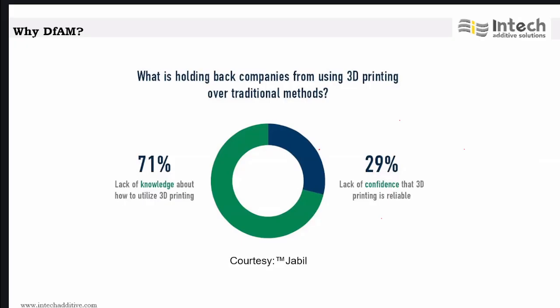It's like designing specifically for the process. They think in a traditional way, thinking about CNC compatibility, or if it is injection molding, about being molding friendly and so on. But 3D printing requires different thinking. It's about leveraging geometric freedom, how we minimize the support, and optimize for layered depositions.